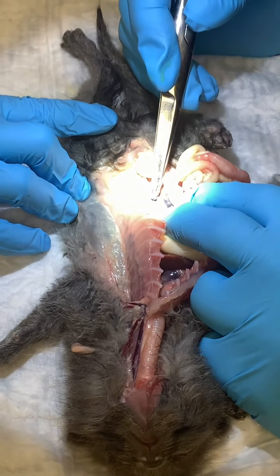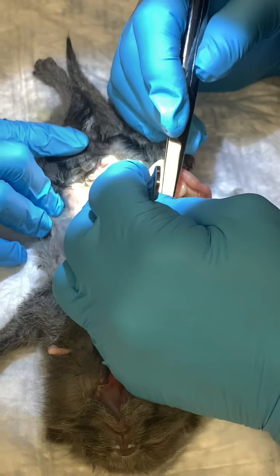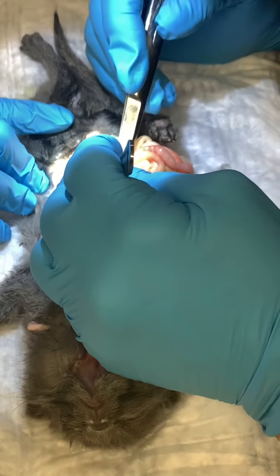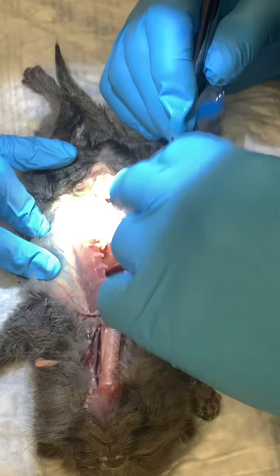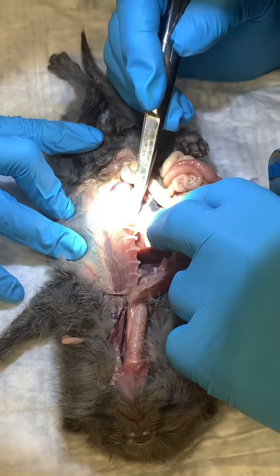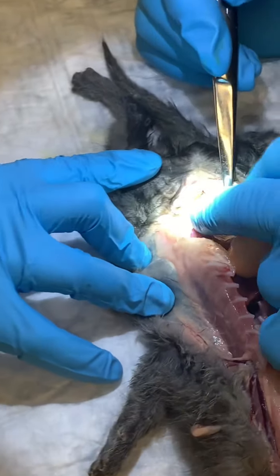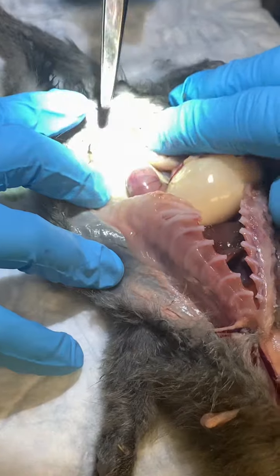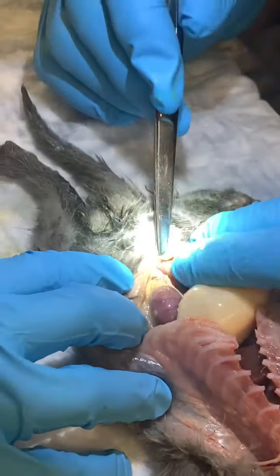It looks awfully big to be the adrenal. But that might be the adrenal. I don't see much pancreatic tissue though. So there's that. There's the bladder and the colon. And then the prepuce back here's hard to see.